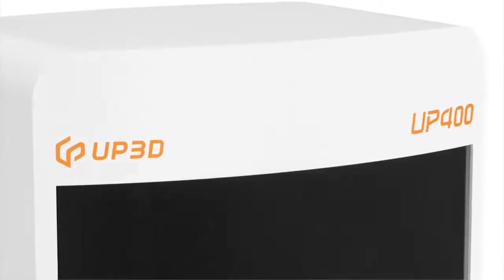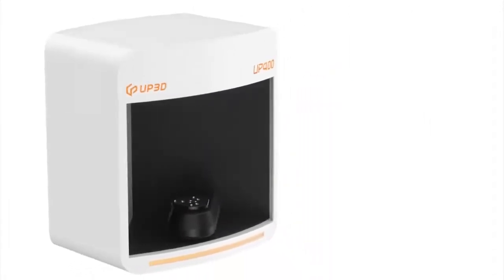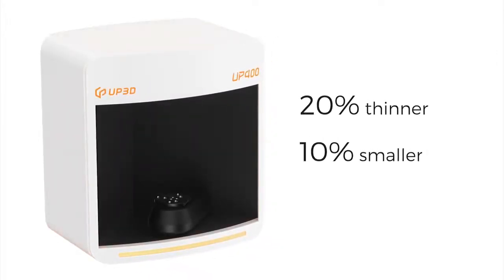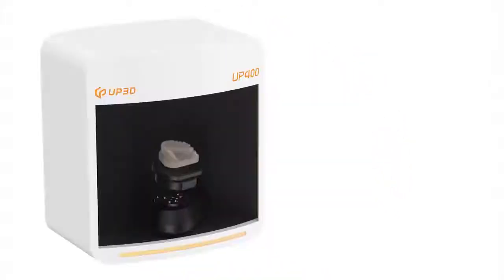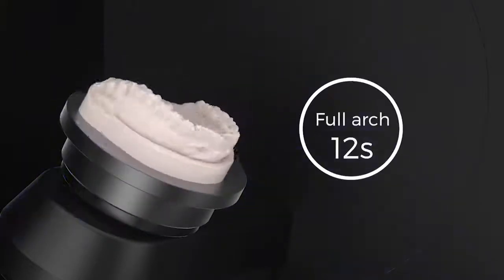Up400 is a newly upgraded ultra-high-speed scanner. From the inside out, Up400 has been redesigned. Its appearance maintains a smaller form factor: 20% thinner, 10% smaller in volume, and 15% less in weight. We have upgraded the fastest scanning engine and efficient software algorithms, with high-resolution cameras and updated projectors. It takes only 12 seconds to scan the entire dental arch, improving work efficiency.